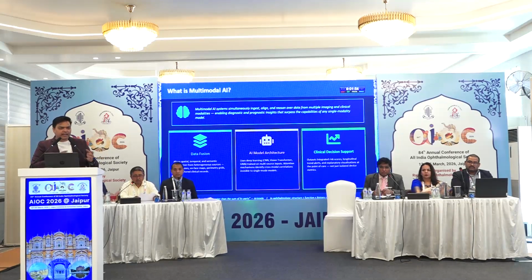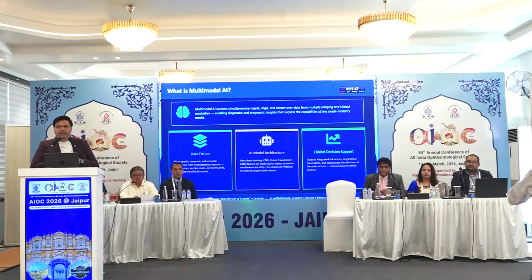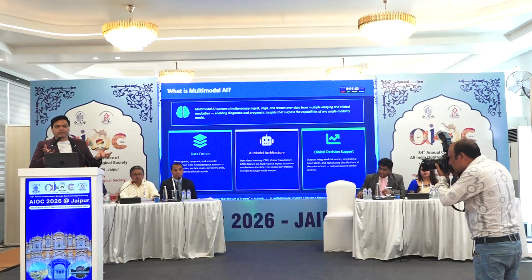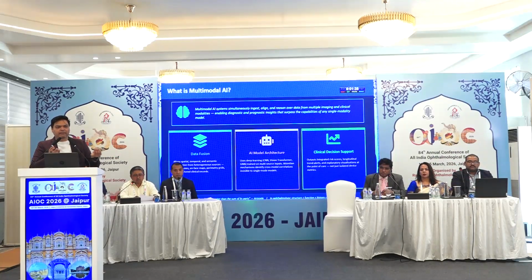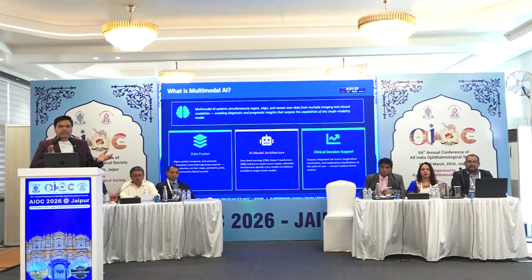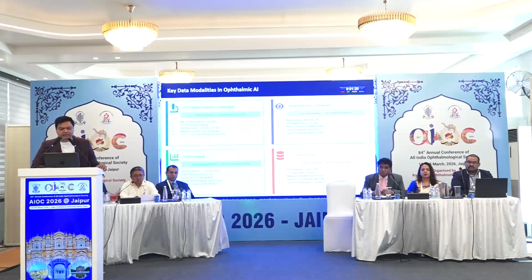We always think that AI is a new thing, but even if you see what the OCT was doing, or what HFA was doing, it was also a sort of artificial intelligence in a primitive form. It was machine learning where you feed data and it compares the normal visual field with the person's visual field and tells that, okay, there is depression, there is a chance that 5% of those patients will have this kind of depressed visual field. So that was also a primitive form of AI. Now we have grown because there is a large amount of data, which we call a large language model. So we are just going a generation ahead in that AI.